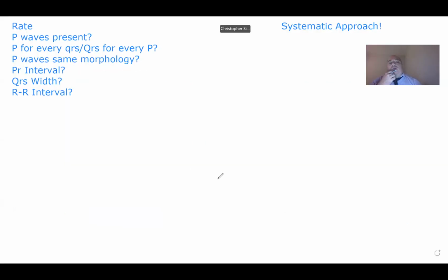All right, so what's happening in a flutter is that the atriums, like in AFib, where they were just quivering, fibrillating. In a flutter, the atriums are beating, but they're literally fluttering, and that's why they call it a flutter. They're just going fast, fast, fast, fast, fast, okay? Much faster than the ventricular rate is. So we're going to do our best to draw it out. So if you had a normal P wave, right?